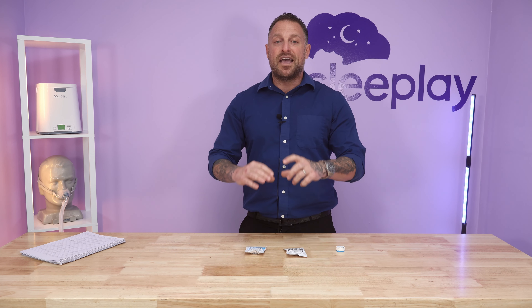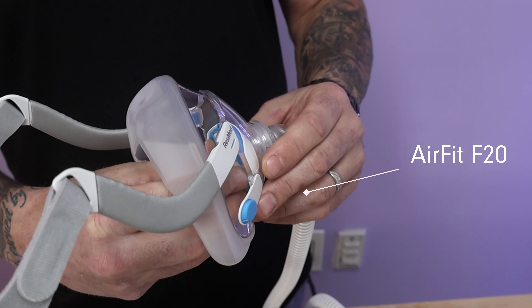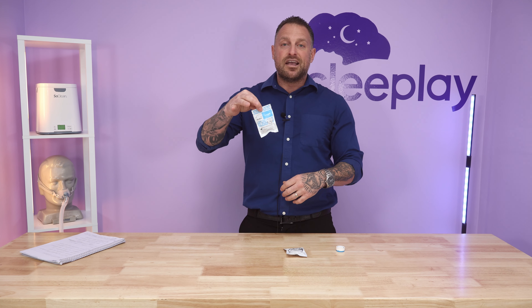They also have the F20 models. It's a bigger disc that goes inside the actual mask, and it provides the same type of humidity as the standard. It's just a bigger form that fits a different type of mask.